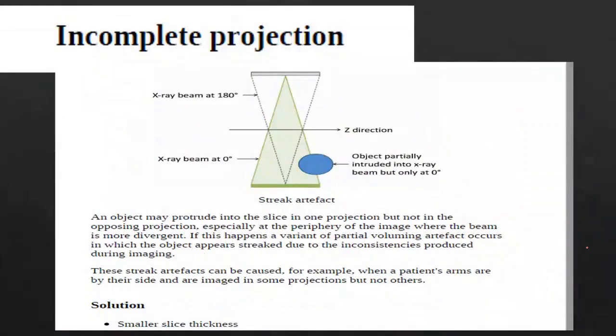There is something called incomplete projection. Incomplete projection means incomplete projection. It's the same idea as the partial volume effect that we are discussing.